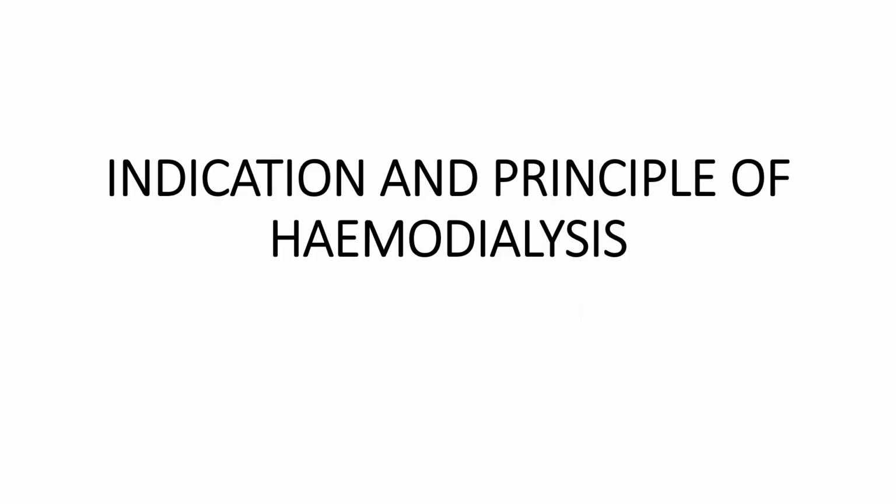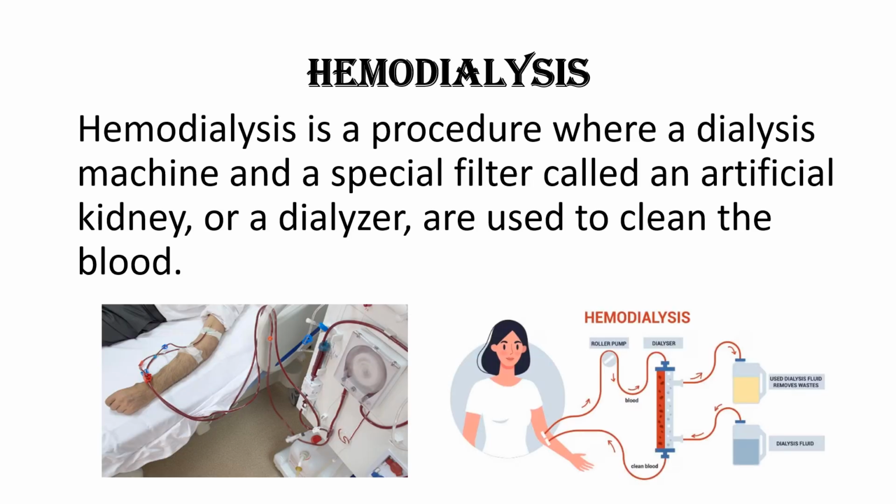Next, we move on to the indications and the principles of hemodialysis. Hemodialysis is a procedure where a dialysis machine and a special filter called an artificial kidney, or a dialyzer, are used to clean the blood.